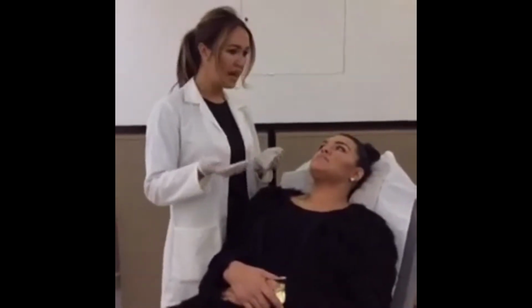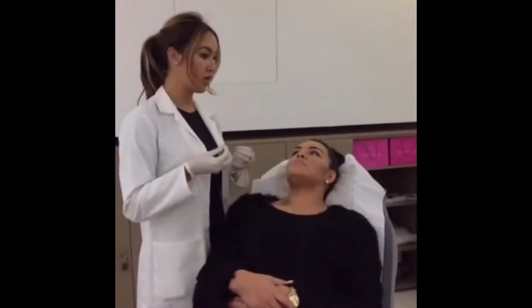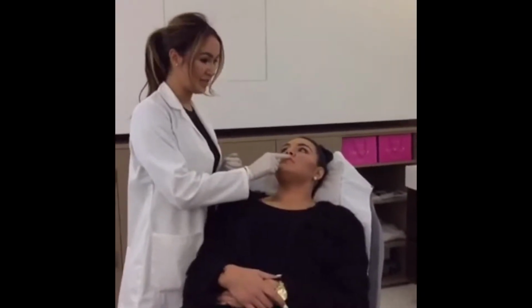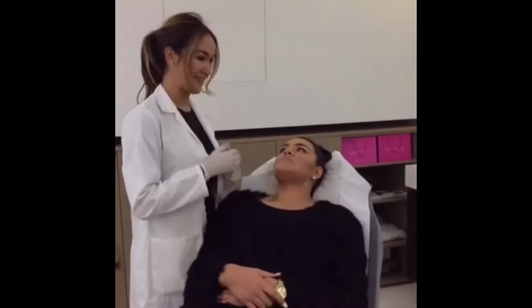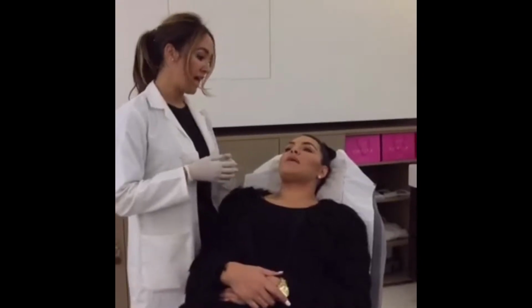3 months down the line? Yeah, a month, 3 months, 6 months, and then you're really going to build the lip pocket gradually. So we want all of the dermal filler and the enhancement to be inside of the lips. We don't want it to be above the lips, where you probably see certain celebrities with this very overfilled, sort of dark look, which is not what you do.